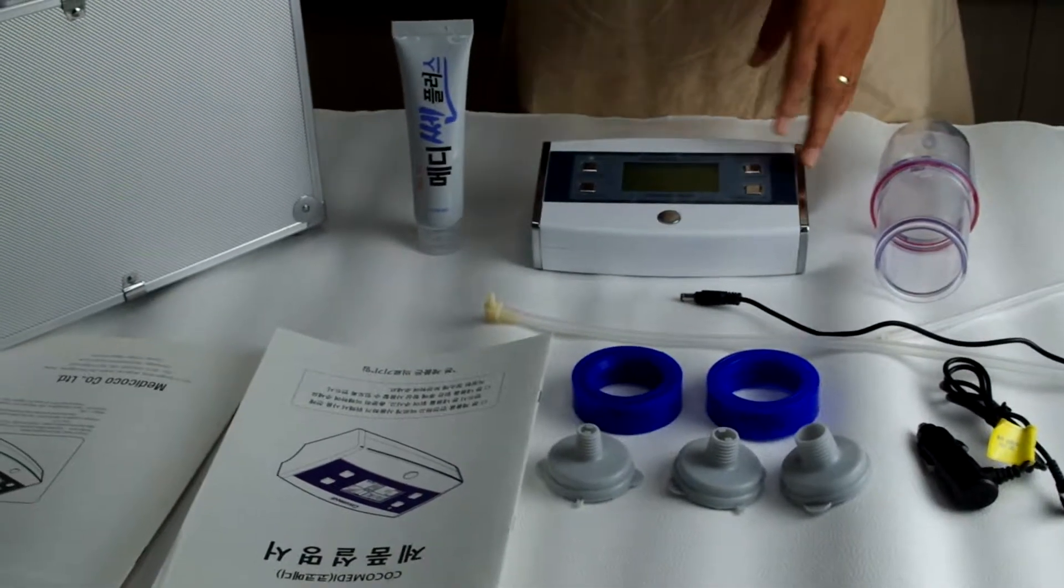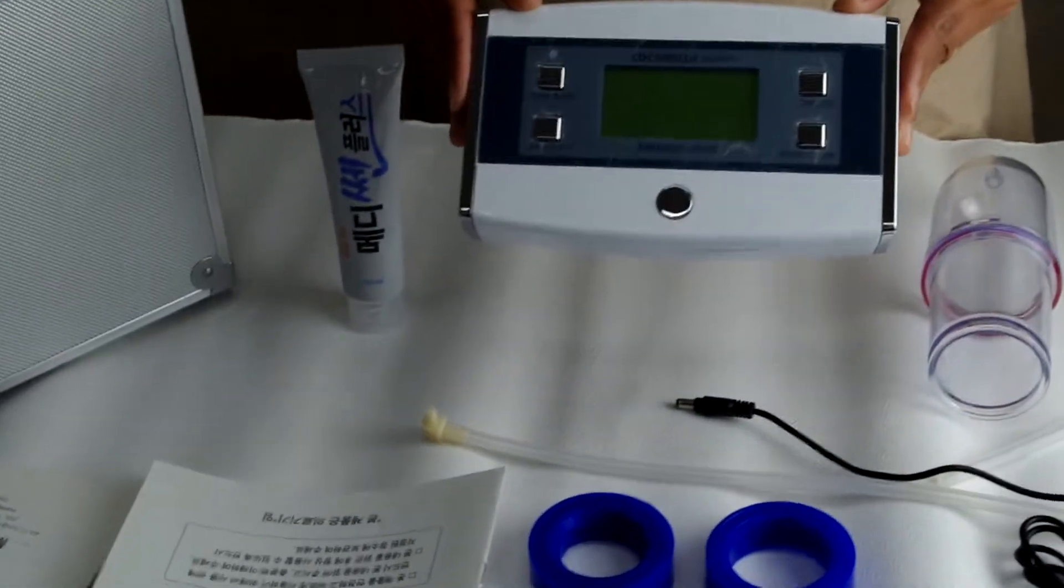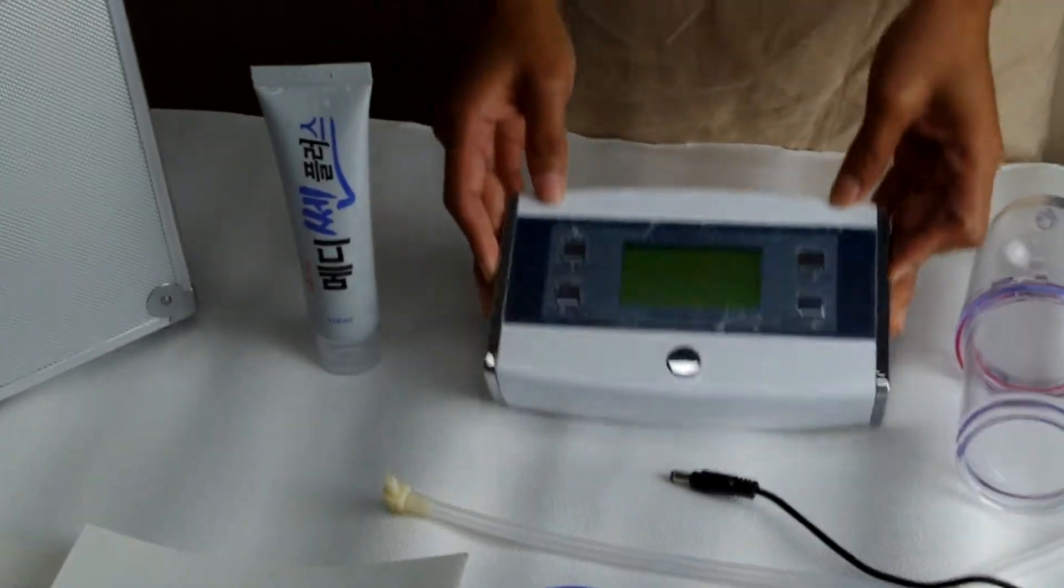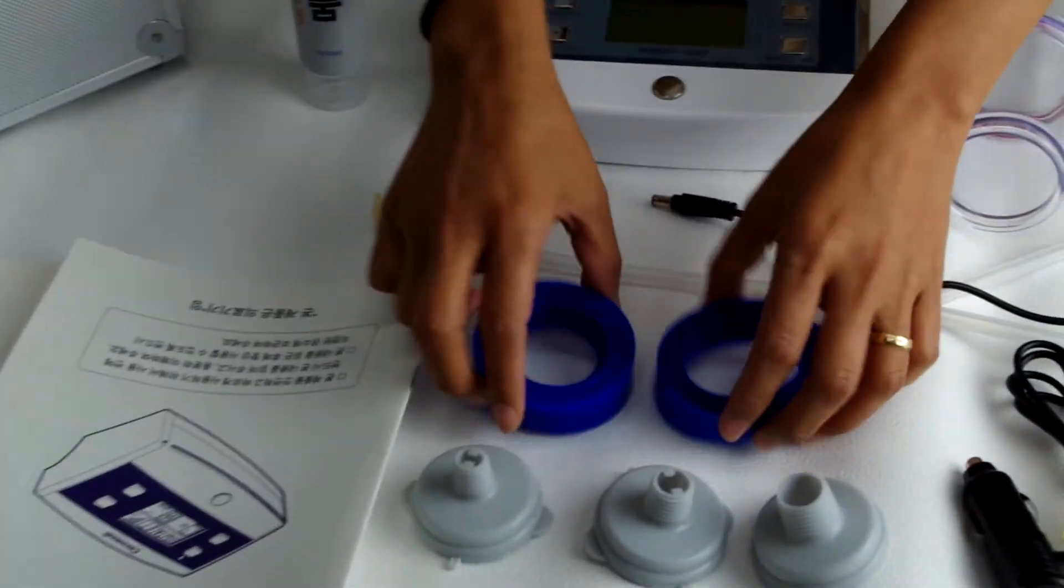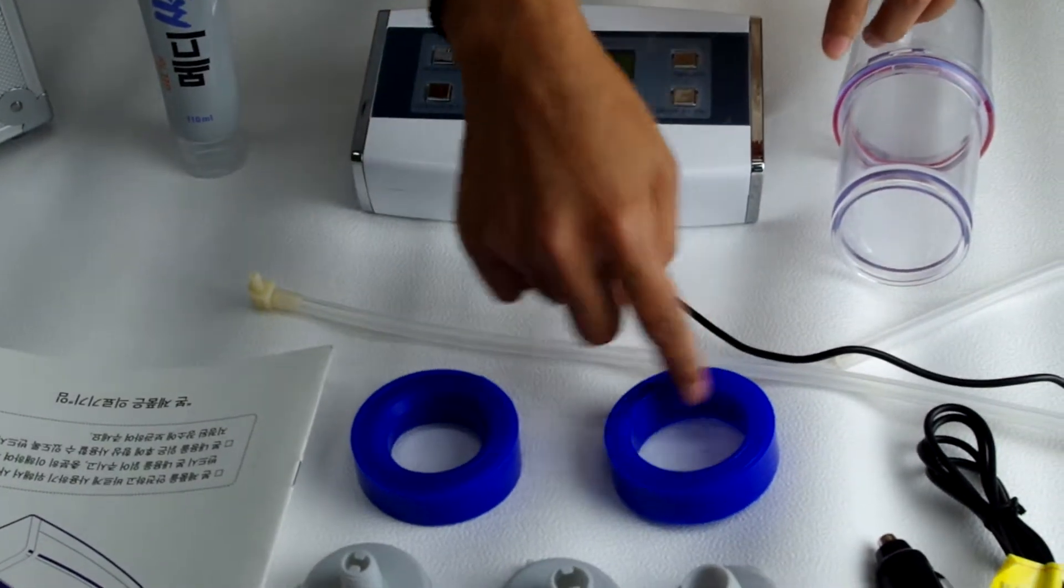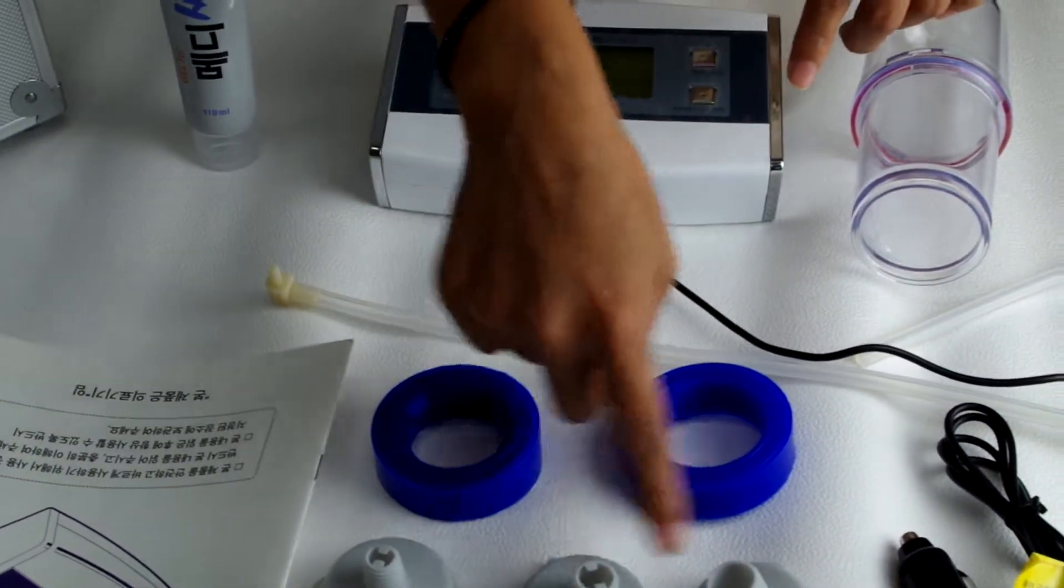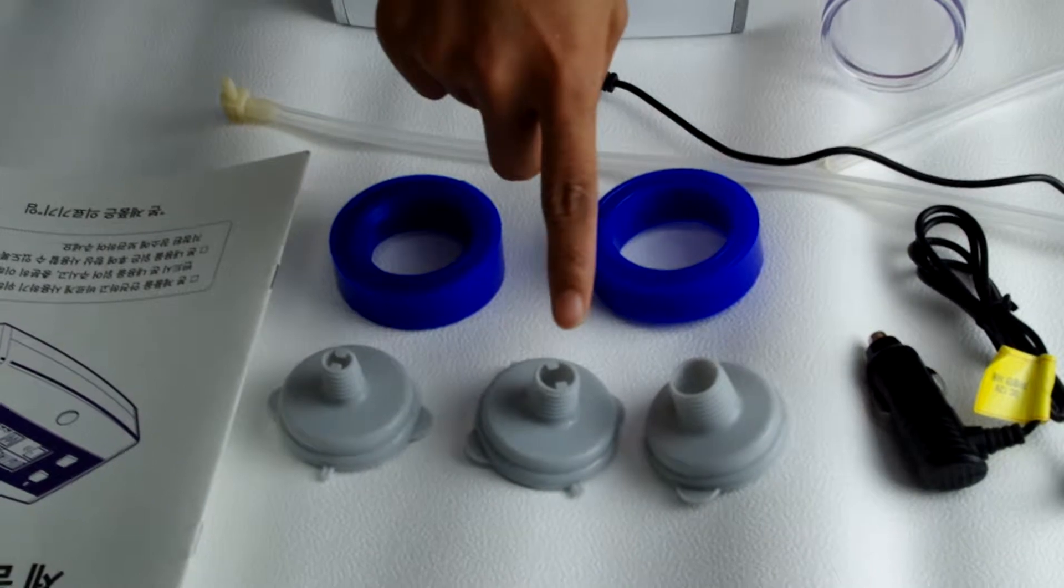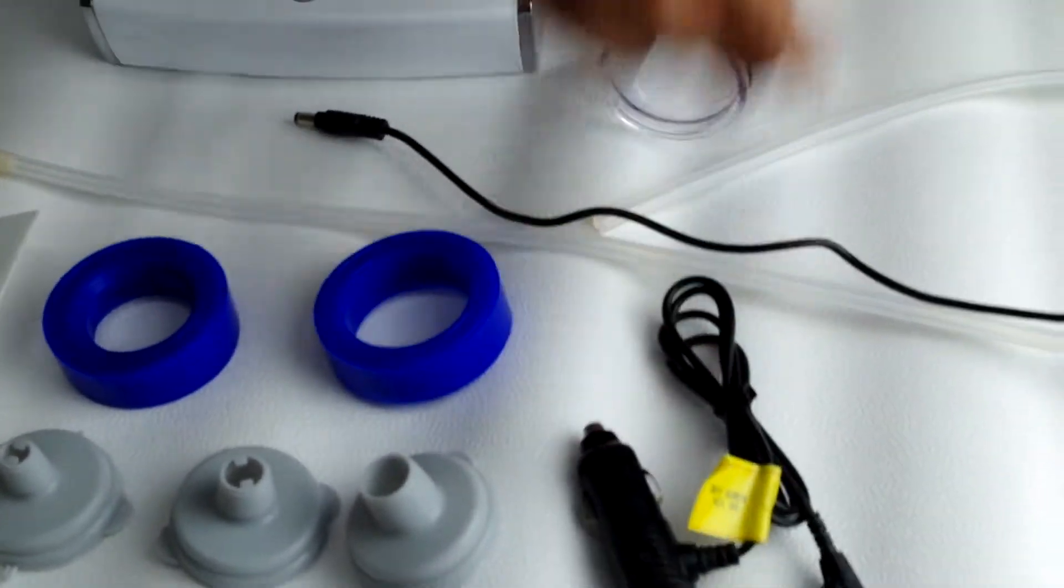These are the sets of Cocomedi product: the Cocomedi device, the automatic device, the two kinds of pressure band (the small size and the medium), the three kinds of protector (the small, the medium, and the large), and the car charger.